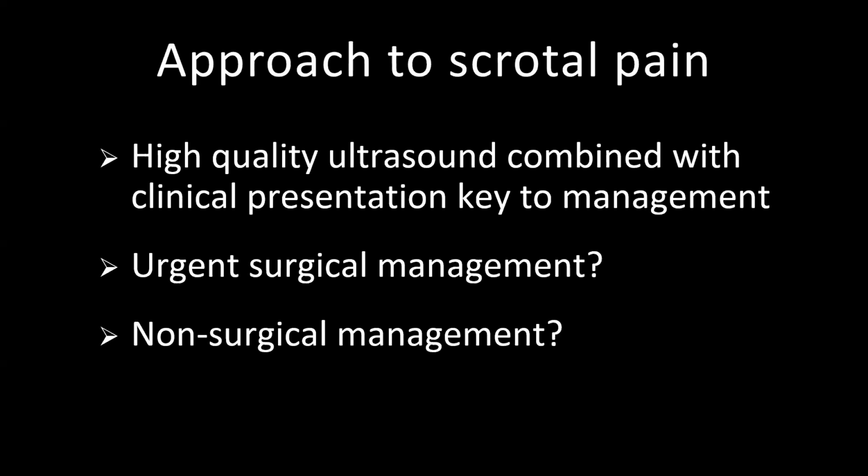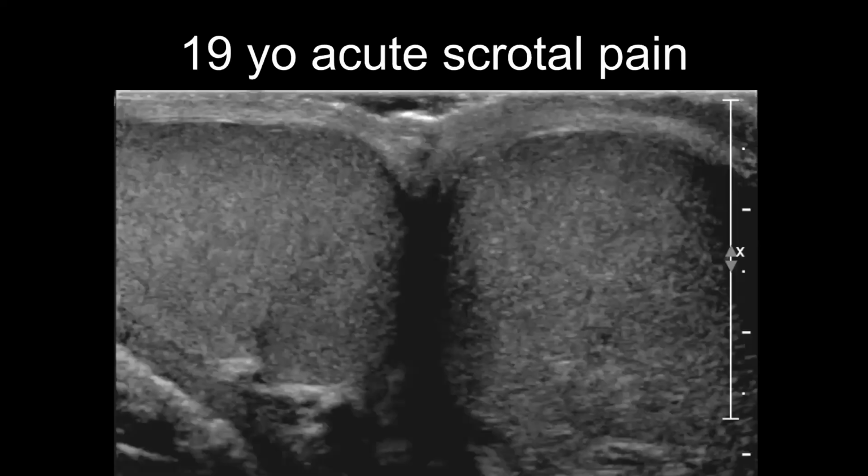Versus non-surgical management. Is it epididymitis? And then I have another category, which we'll go over. This is our first patient, a 19-year-old with acute scrotal pain. Our side-by-side grayscale images. I think on these images, the echogenicity looks pretty similar to each other.